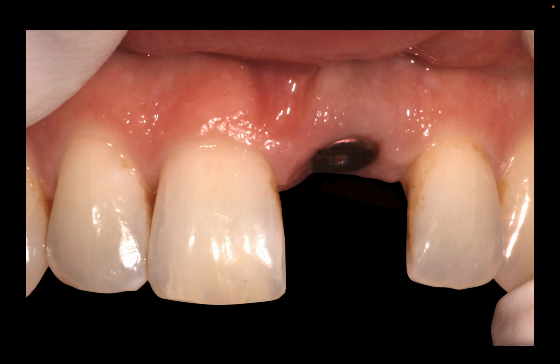Now I want to show you a different case. This is Sophia, to demonstrate what I'm talking about, because in Barbara's case I'm doing adjacent teeth. In Sophia's case, I'm only doing one tooth, one central. If you look, I've got a standard healing abutment in place, right? Even though she's got a long contact, you can still see there's going to be a slight little gingival triangle.